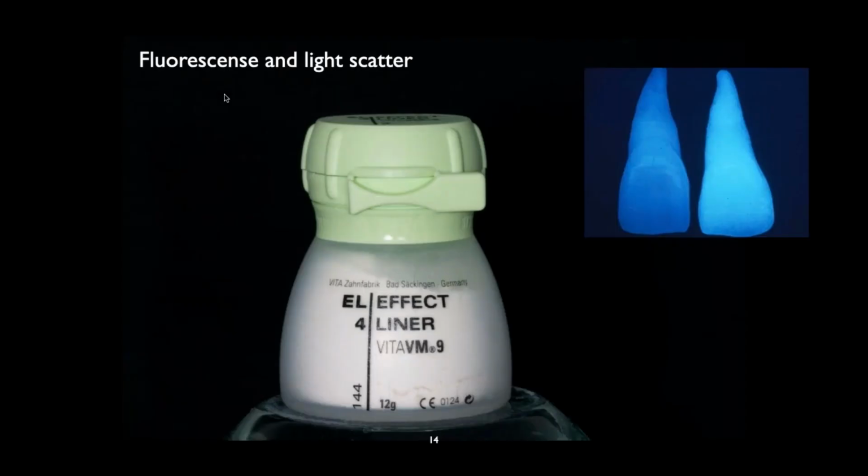The effect liners on the VM9 and VM7 originally would fluoresce. And so you put this on top of the zirconia coping or the structure, fire this to a sheen, and sometimes you have to bond the zirconia.